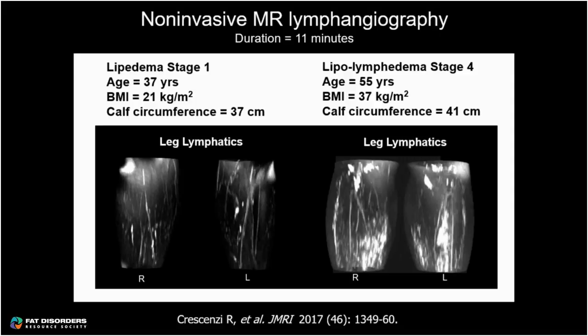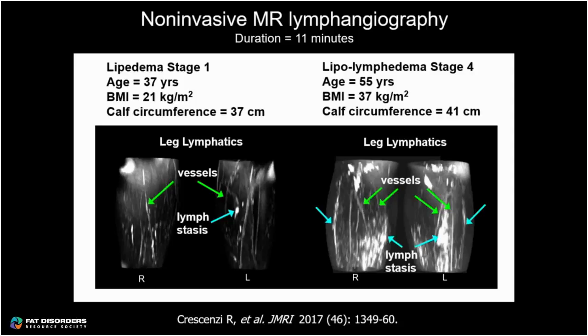These are examples of non-invasive MR lymphangiography using MRI from a stage one patient with lipedema and a patient with lipolymphedema characterized by pitting edema, acquired below the knee down through the ankle. The green arrows point to vessel structures — there are more visible in the patient with additional lymphedema. The blue arrows point to pockets of fluid stuck in the tissue, consistent with lymph stasis, which becomes a cloudier appearance of signal in advancing lipolymphedema. These images were acquired in 11 minutes without contrast agent.